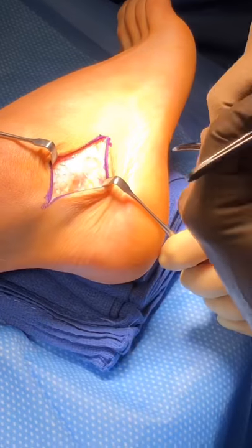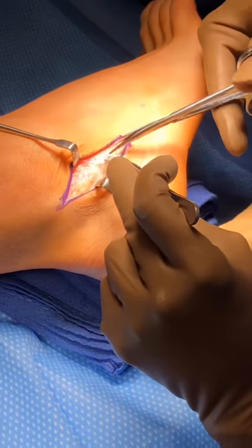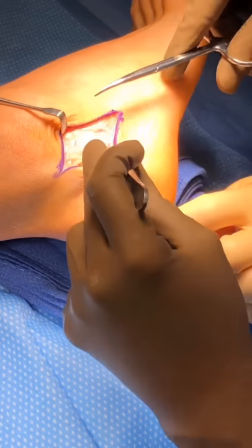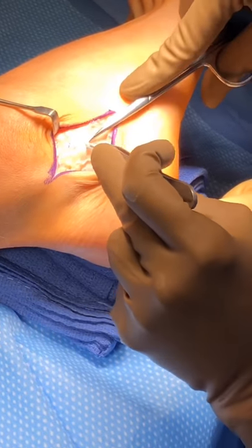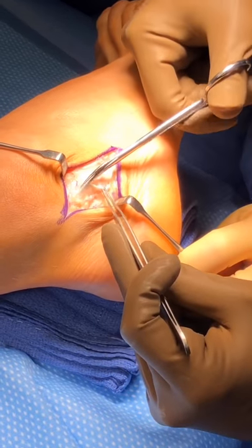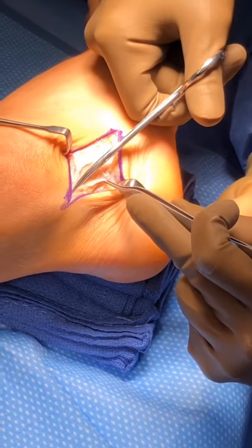Here are the peroneal tendon sheaths, so we'll get into the peroneal tendon sheaths here of the longus and the brevis. And you can see already he has a lot of fluid that's coming out of the tendon sheath, which is indicative of an issue.